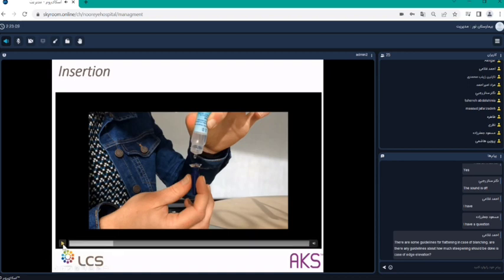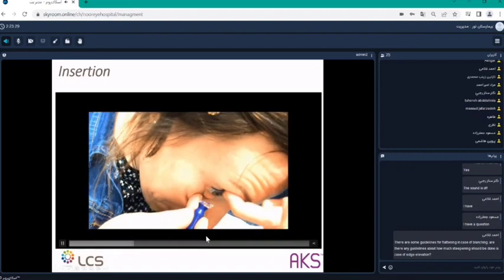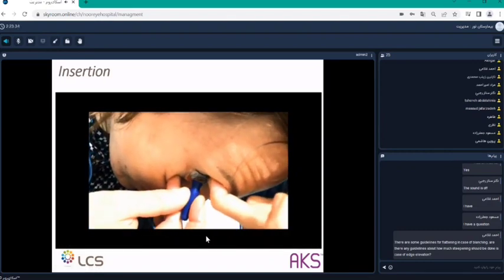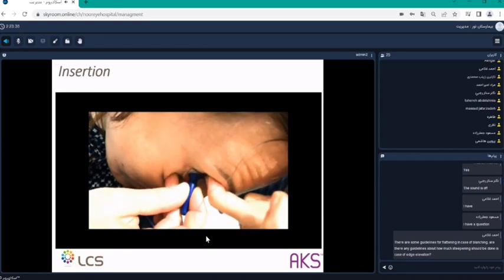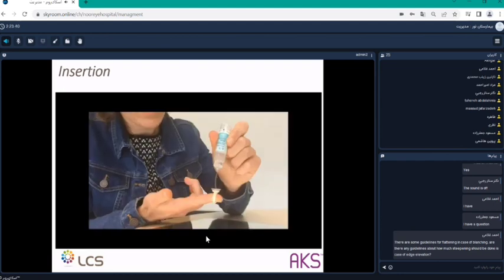So when the lens is filled, the problem is, of course, there is an excess of weight. That is the reason why you need a small support, like here, this typical scleral suction holder, in order to stabilize the lens, and then the lens has to be inserted like that. Most of the time it is not a problem when the patient has succeeded once.